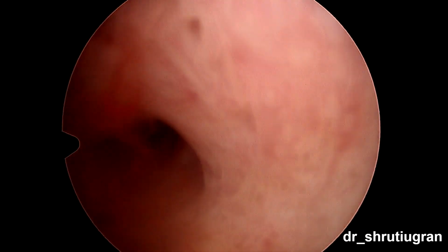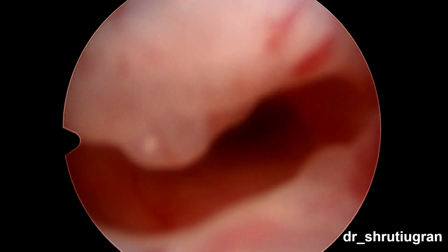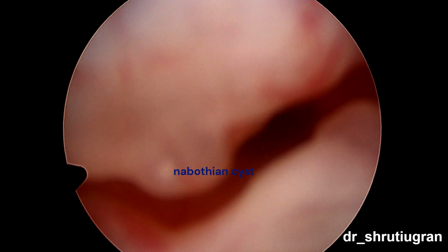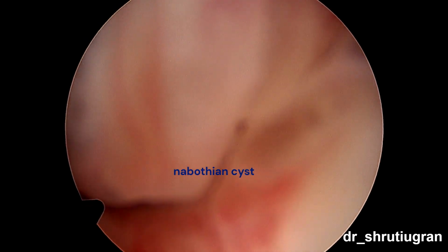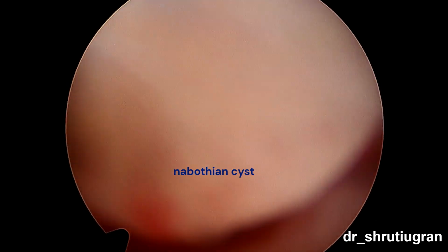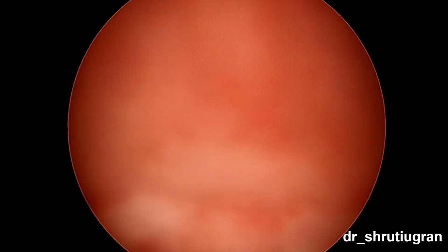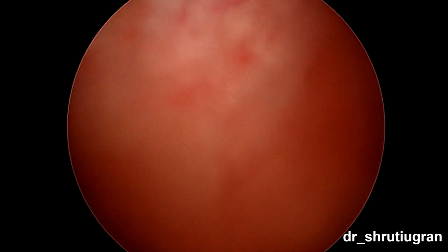Here, as we can see, we are going in with the vaginoscopy technique, which is the standard hysteroscopy entry in all fertility cases. Here we can see a Nabothian cyst on the anterior wall of the cervix, and now we are trying to negotiate the internal os. We are using a 2.9 mm hysteroscope over here, and here we have negotiated the internal os and entered into the uterine cavity, just waiting for the cavity vision to clear.